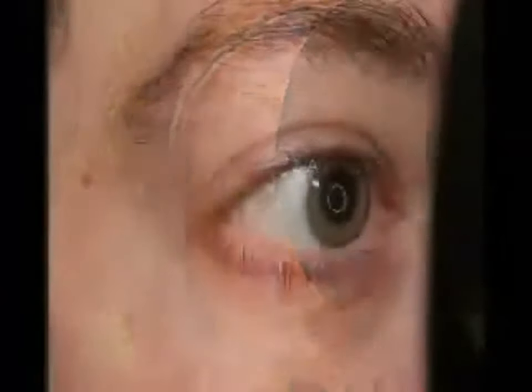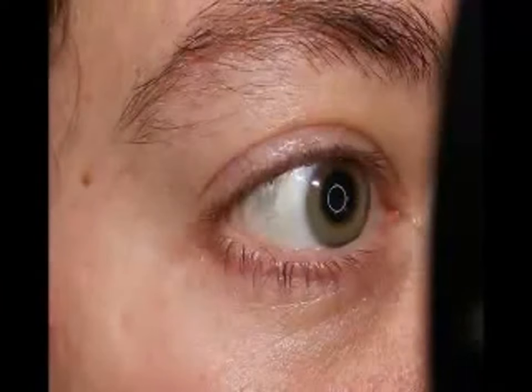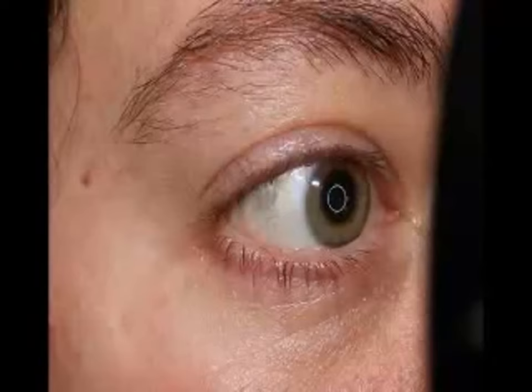Turn the instrument to point directly at the eye being measured. Looking from the left side of the instrument, you will see a bright white ring in the center of the patient's right eye. If the bright white ring is not in the center, you may use the elevation knob to center the ring. Once the correct position has been established, instruct the patient to fixate on the green light inside the instrument.